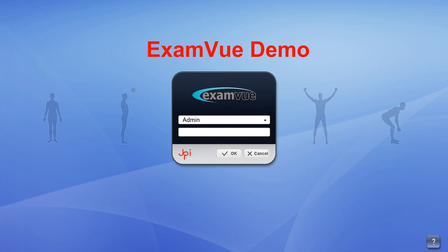The video will be a quick guide on registering patients and taking x-rays using JPI software, ExamView DR. The first step is to log in.